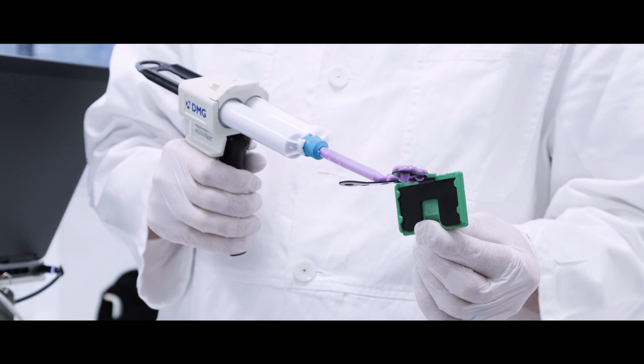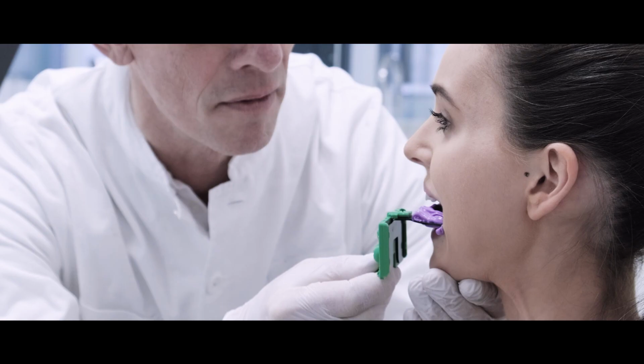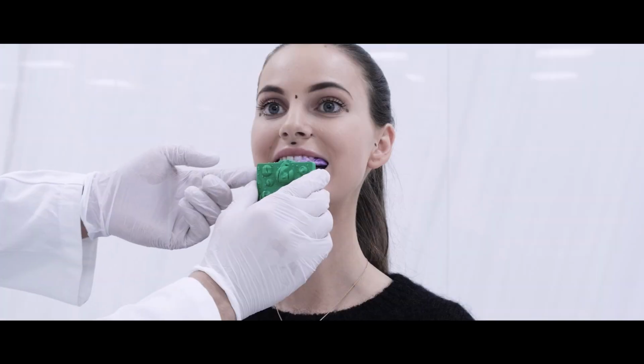Then the dentist takes scans of secondary views, with smiling, open-mouthed and possibly phonetic expressions. A system called transfer fork is used to relate digital models to the patient's face.